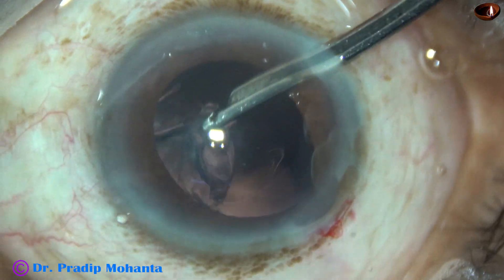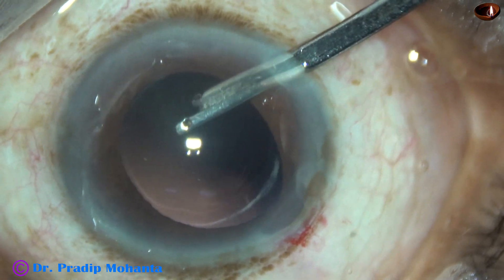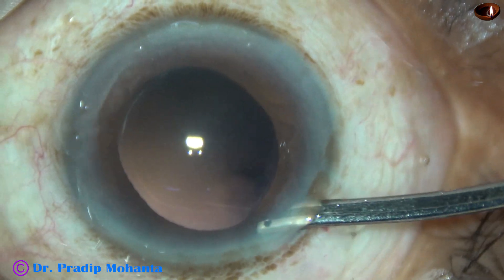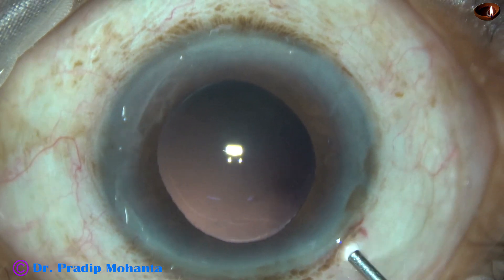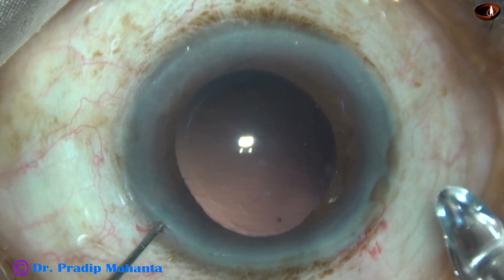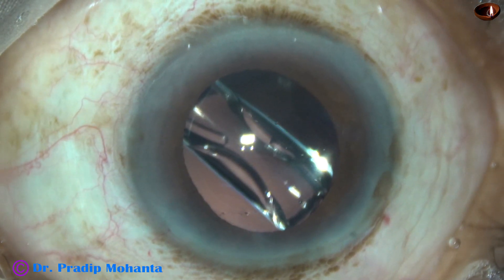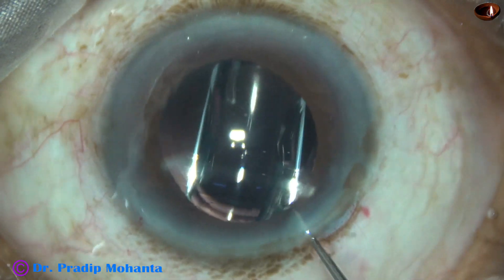This is a very thin 23G Simcoe cannula, and it goes very easily through a wound of 1.8 mm. The iris is reposited now. The anterior chamber is now filled up with 2% hydroxypropylmethylcellulose, and then a hydrophobic acrylic single-piece monofocal intraocular lens from Bausch and Lomb is implanted in the capsular bag. This lens is known as Envistta. Now the viscoelastic is nicely removed.